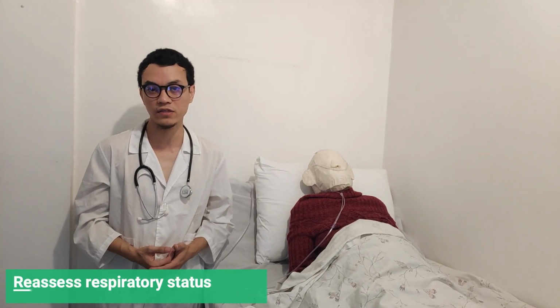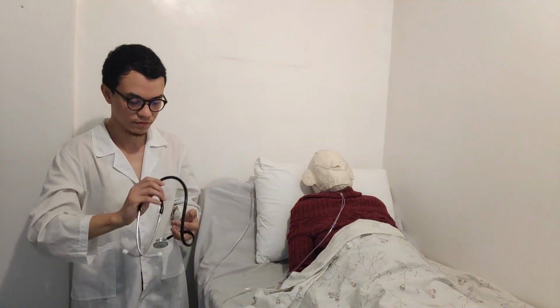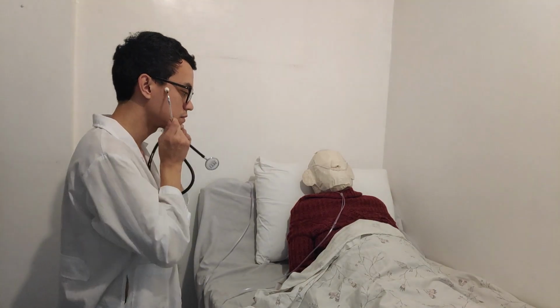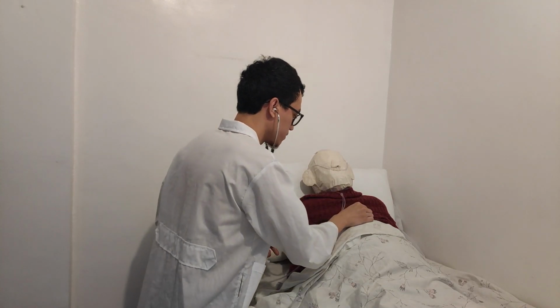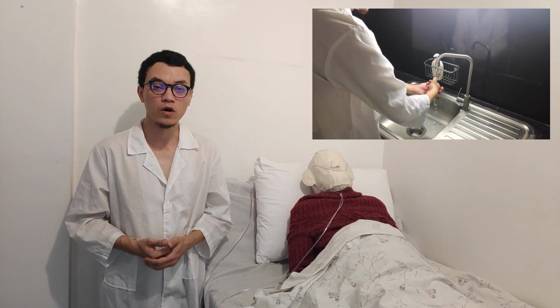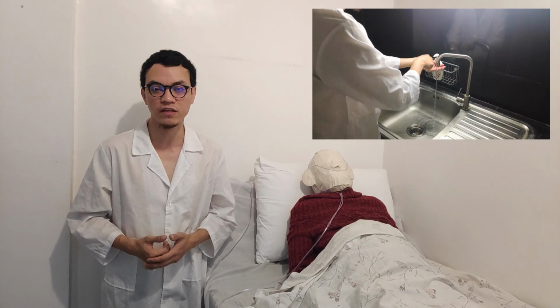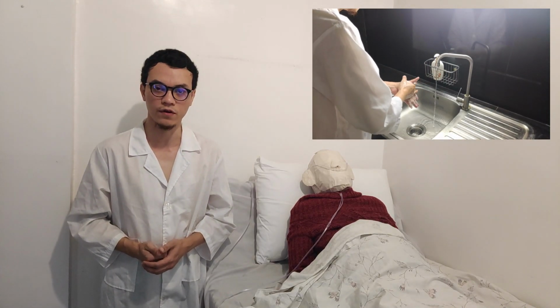Next is reassess the patient's respiratory status, including respiratory rate, effort, and lung sounds. Note for any kind of respiratory distress like tachypnea, nasal flaring, and use of accessory muscles. Next is remove PPE if used and perform hand washing. Again, hand washing is very important because it prevents transmission of bacteria and microorganisms from one person to another.